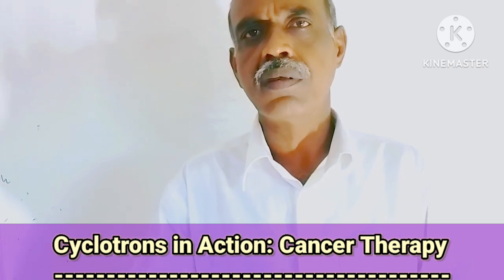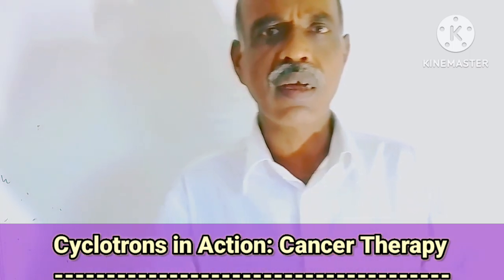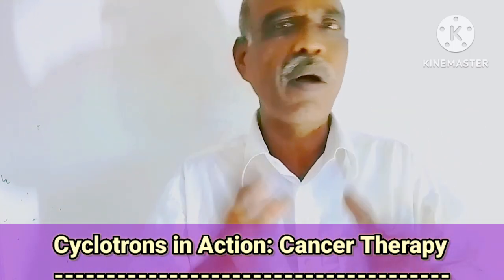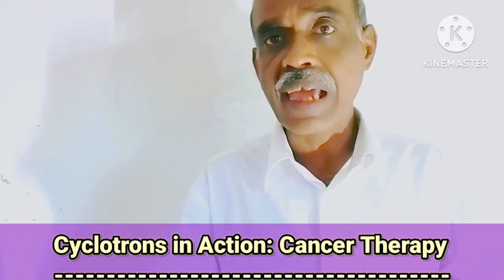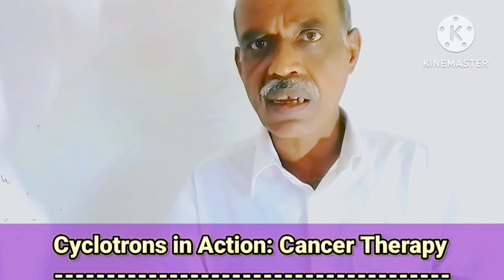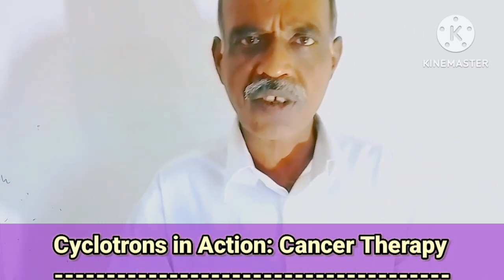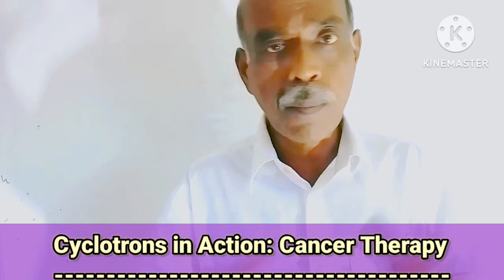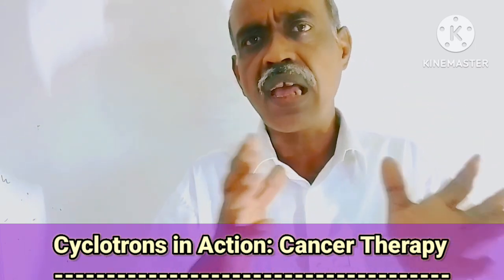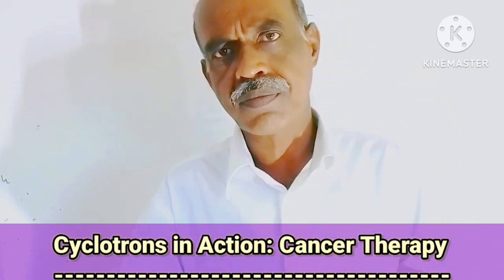Cyclotrons in cancer therapy. This is the topic of discussion in today's lecture. Cyclotrons, what is this? A cyclotron is a particle accelerator. It can accelerate only charged particles, like protons and electrons. Protons are positively charged and electrons are negatively charged. But this type of accelerator cannot accelerate neutral particles, meaning electrically neutral particles.